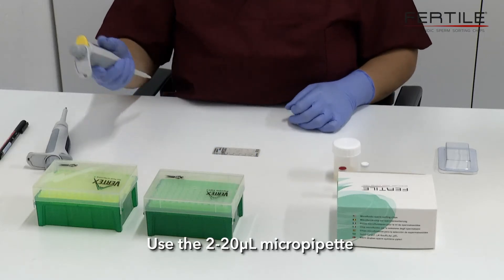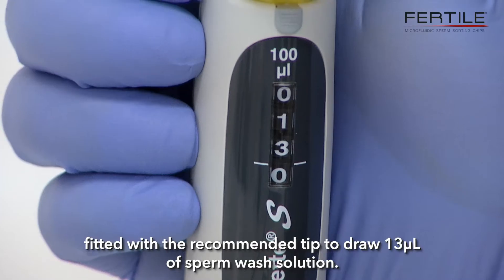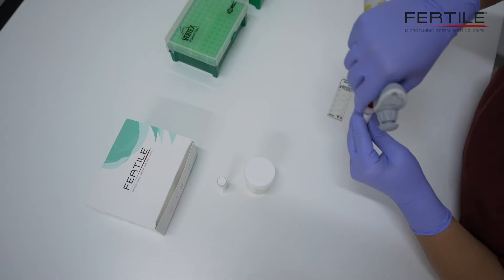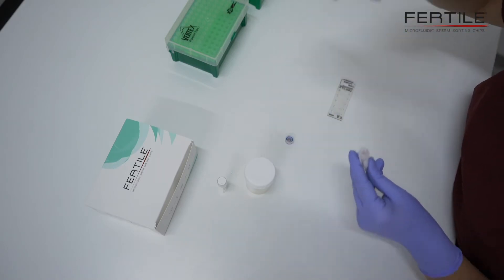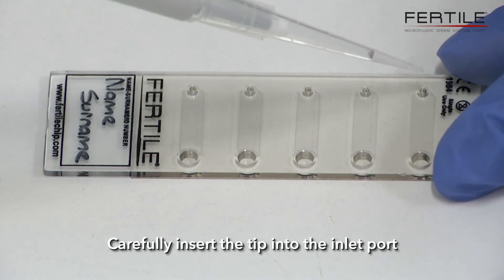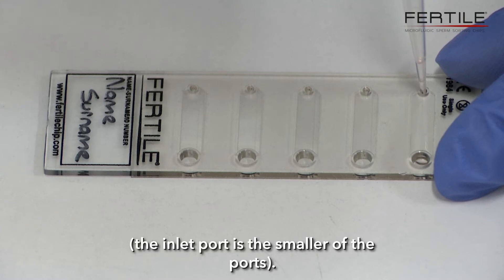Use the 2 to 20 µL micropipette fitted with the recommended tip to draw 13 µL of sperm wash solution. Carefully insert the tip into the inlet port — the inlet port is the smaller of the ports.